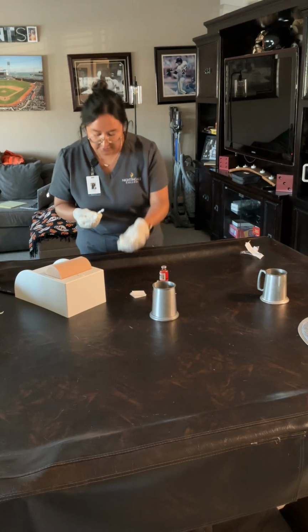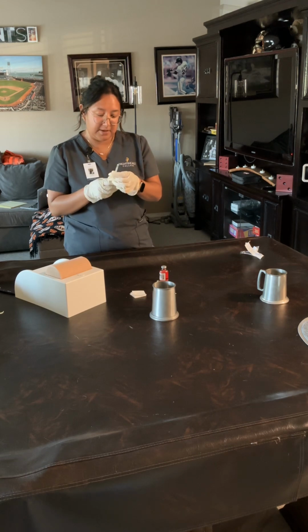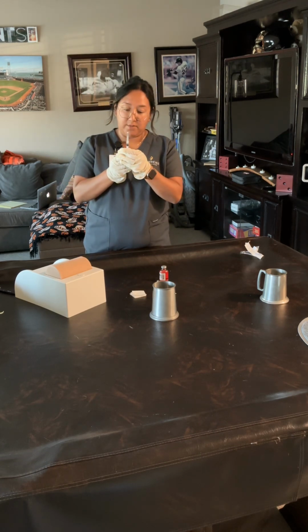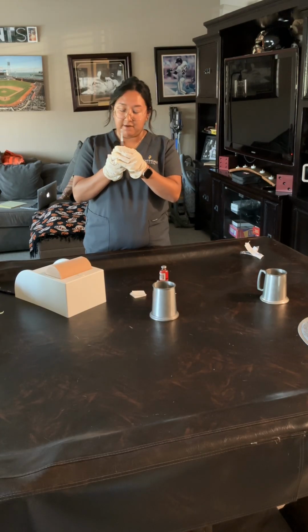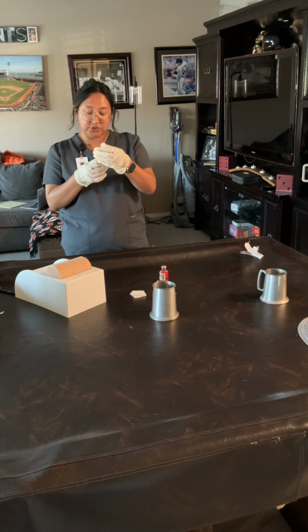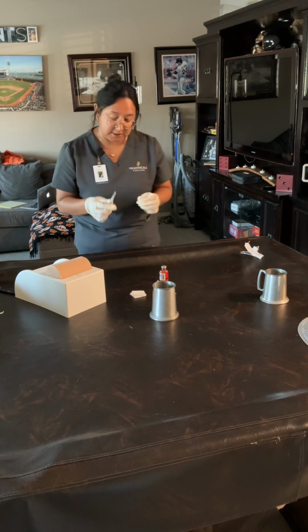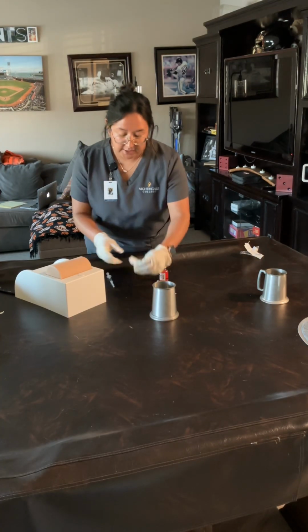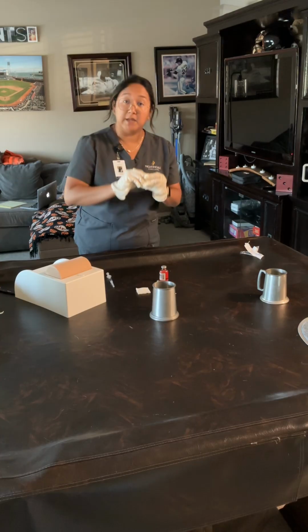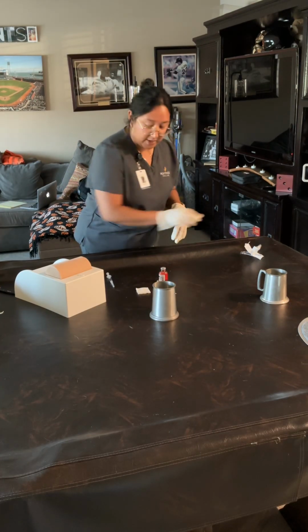And then next I will go ahead and connect this through and leave it capped. And then I will go ahead and draw up 1.5 milliliters of air. And I'll go ahead and inject the vial here. Actually, I forgot to clean my vial. So again, I'm out of alcohol pads, so this is the alcohol pad. I'm going to open the pack, go ahead and clean the vial here. I'm going to throw that away.